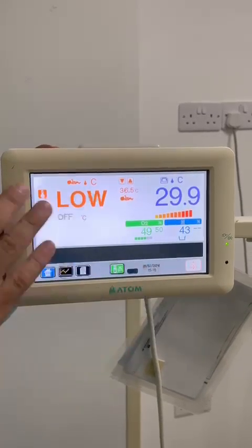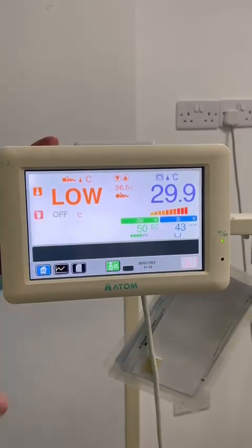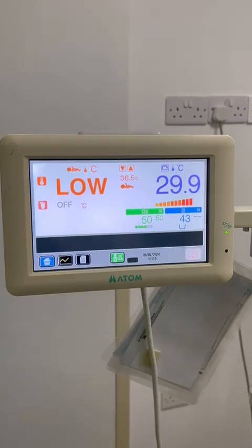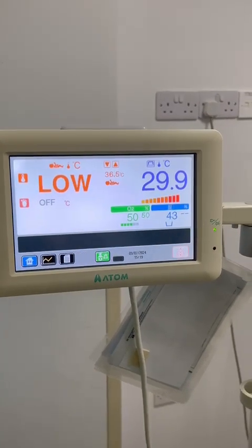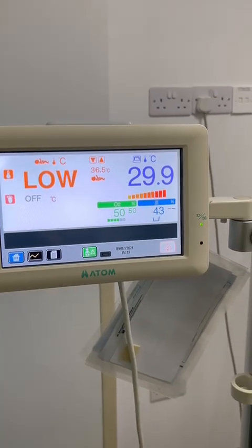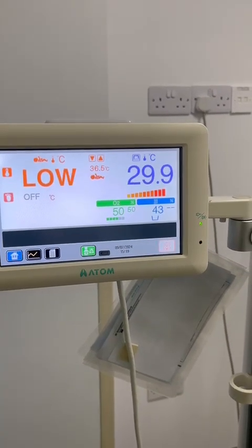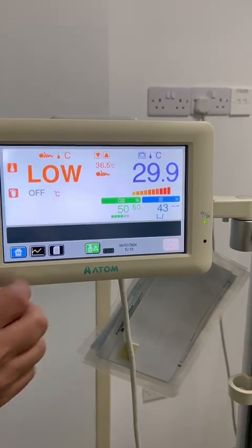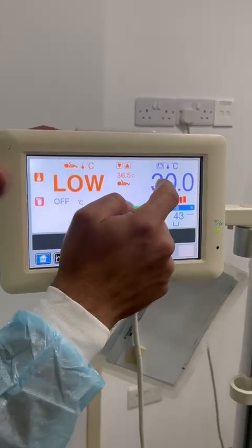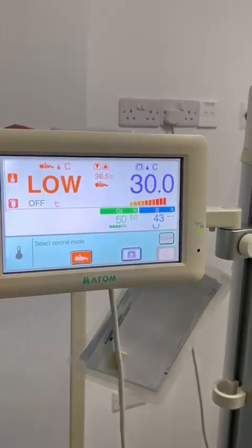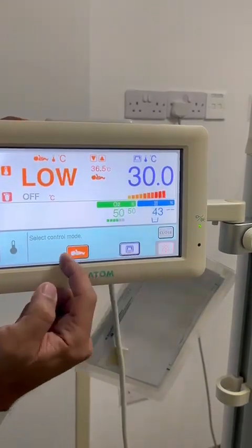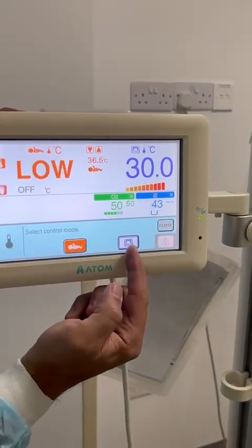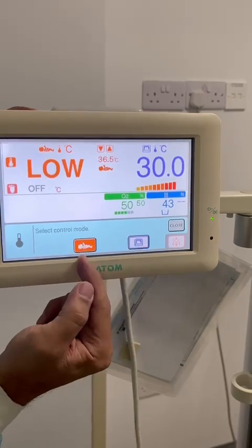How to control the temperature? There are two different ways. The first one is the manual control mode, and the second one is the skin control mode. If you go to the touch display, here you can select between manual control mode or skin.